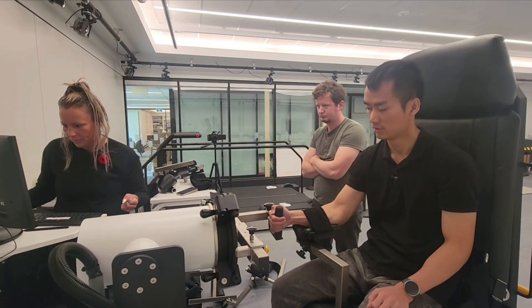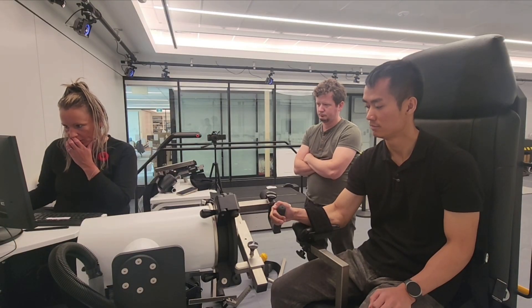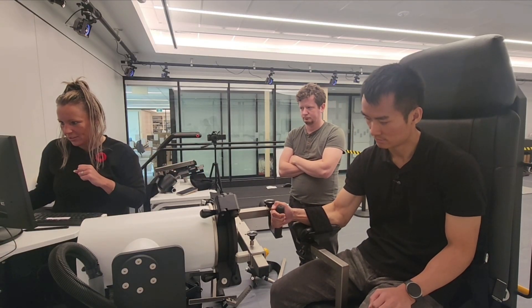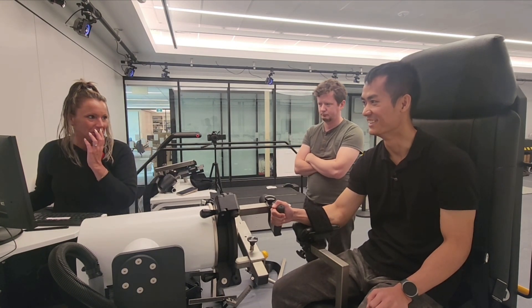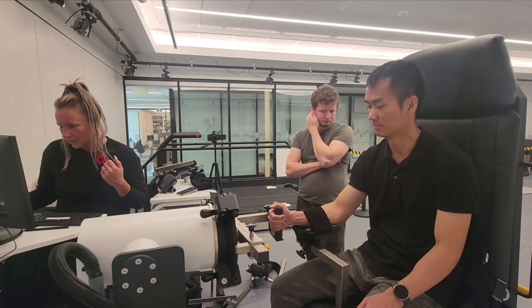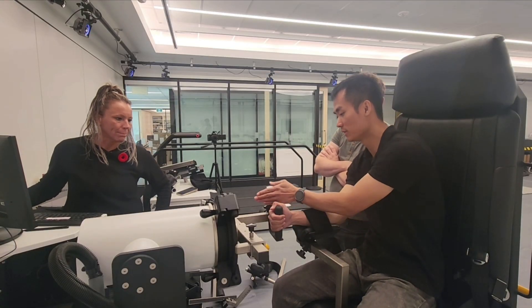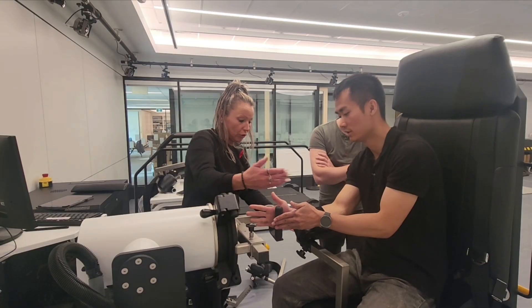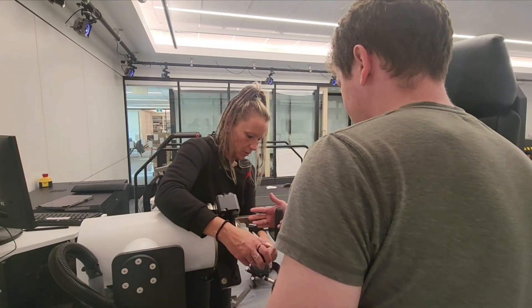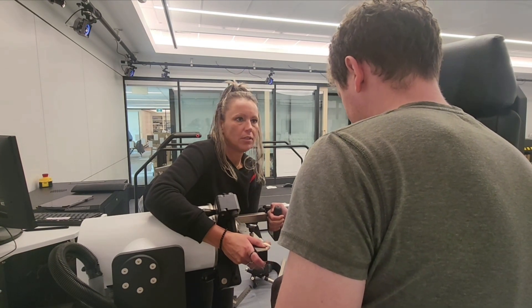Twist left and right. Twist left, and then twist right. Let's see if we go forward and check — this is already heavy. Come back the other way. Let's see if it'll work. If it was a little bit more this way, are you able to move it this way a little? We can make this longer. I feel like if I can have more torque that way. Yeah, that feels better? That's an easy one to fix for sure.